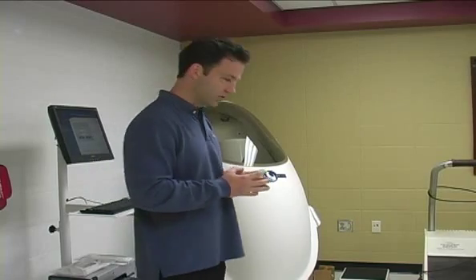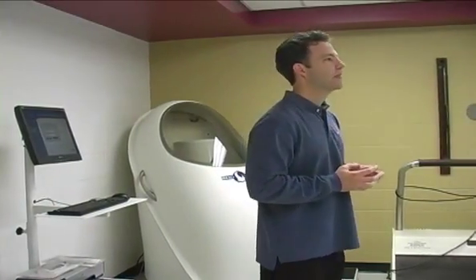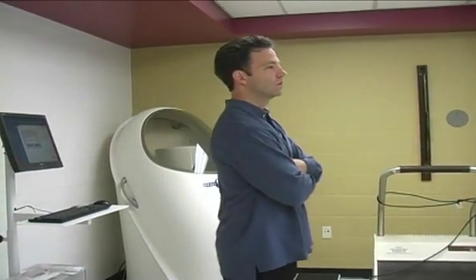Can I ask a question? You mentioned that it's been validated against hydrostatic weighing. How has, and I'm assuming against DEXA also, so can you say anything about the DEXA technology versus this?